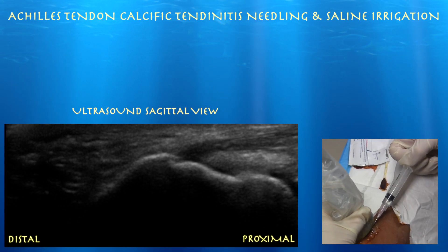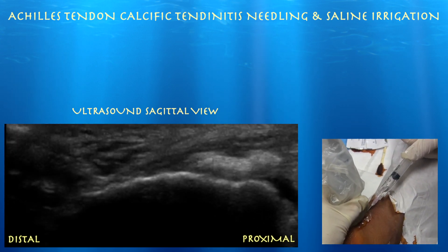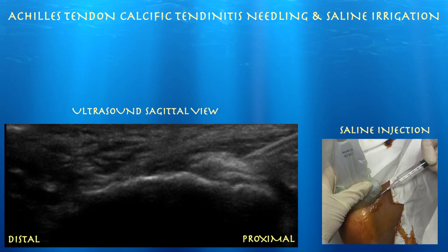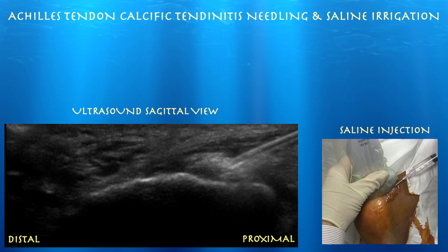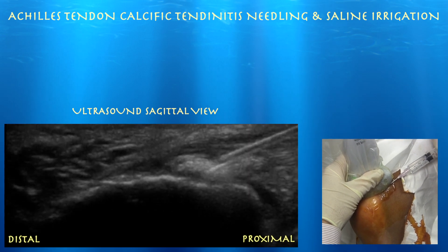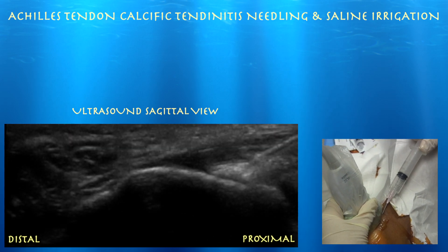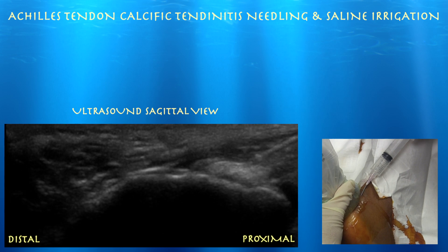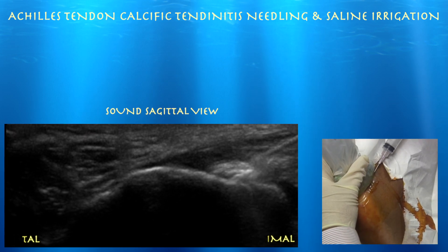We have injected most of it in. I'm going to try to get some back now — we're not really getting anything back. We're about to inject some saline, again as a way to just break up this calcium deposit and let the body absorb it — just breaking it apart now. I don't want to be too aggressive here because this is an Achilles tendon. Also, we are using an 18-gauge needle, so you don't want to over-fenestrate the Achilles tendon as you don't want to cause a tear.